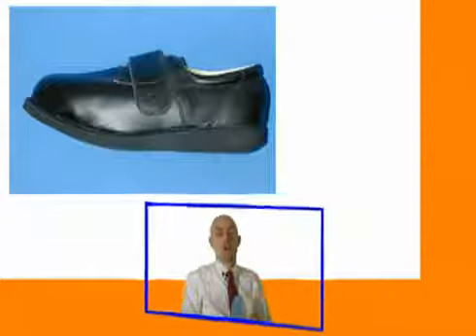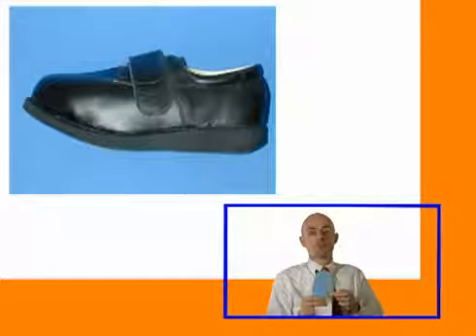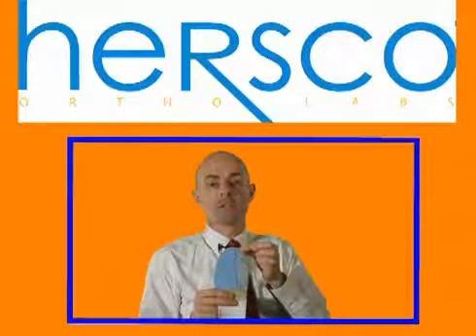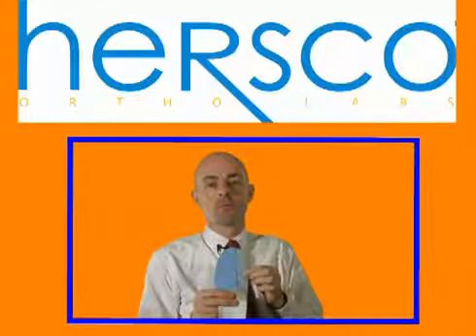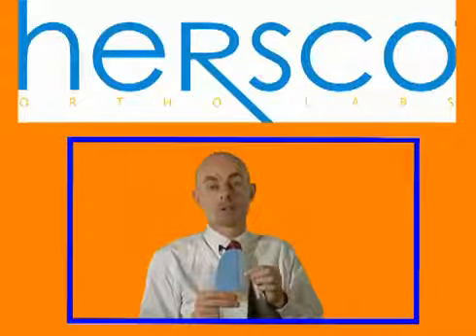off. A more conservative approach is to use a reversed Morton's, which essentially takes a channel out underneath the first all the way to the distal tip of the hallux. This allows the first to float a little more, and as a result transfers weight over to the second and third metatarsals. It is a mild correction, and it only works for some of the cases.